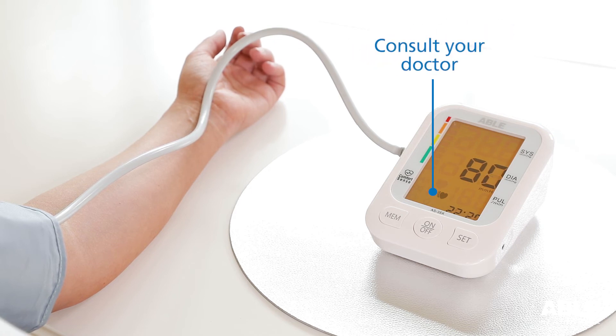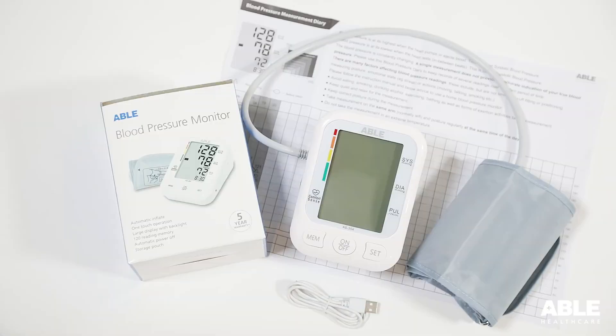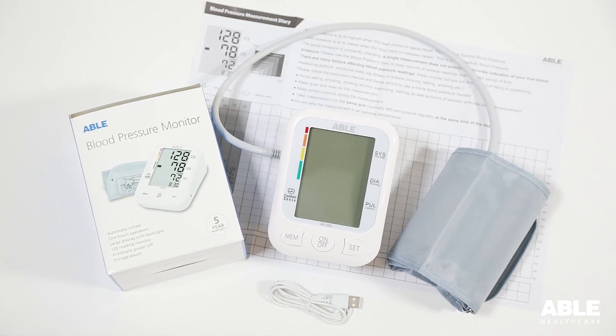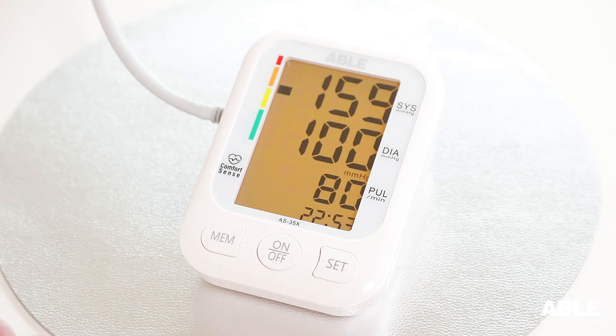We recommend you consult your doctor if this occurs frequently. When the measurement is completed, your blood pressure will be displayed on the screen. A marker will show where your result fits within world health standards. The ABLE blood pressure monitor will store 120 readings. To view these, press the memory button.